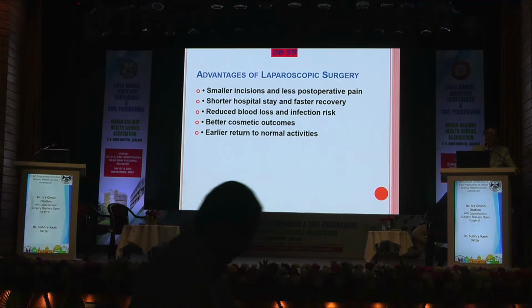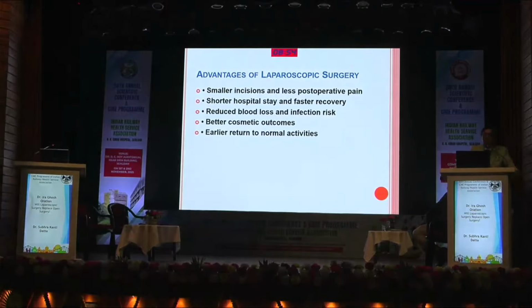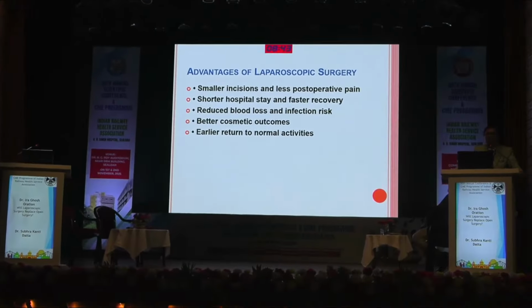Advantages of laparoscopic surgeries, as you all know: smaller incision, less postoperative pain, shorter hospital stay, faster recovery, reduced blood loss, reduced infection, better cosmetic outcome, earlier return to normal activities.